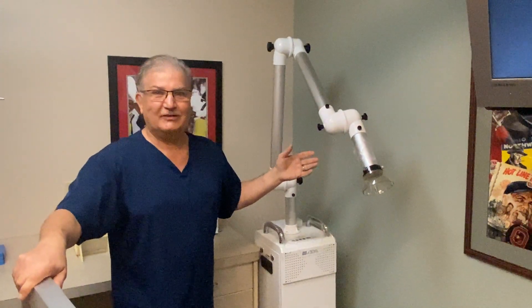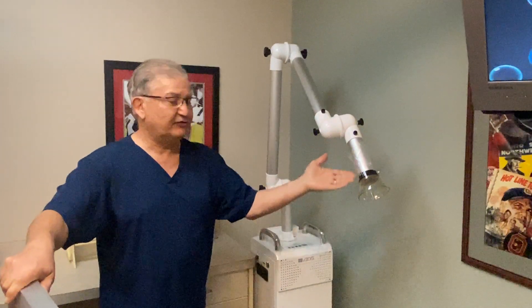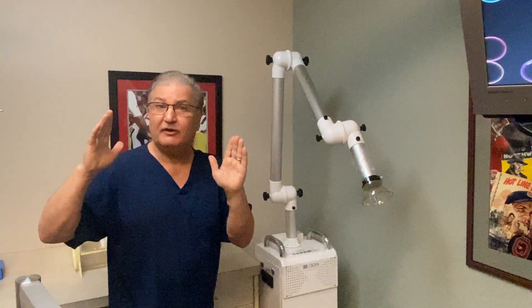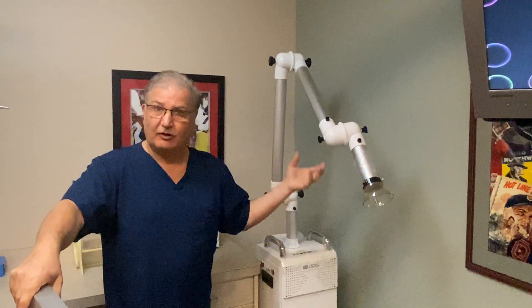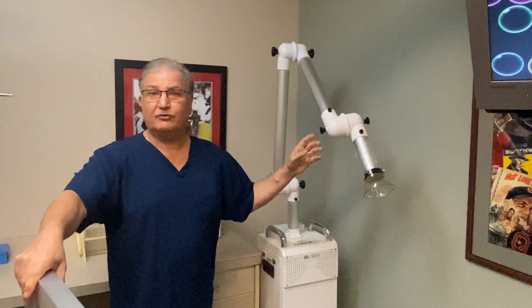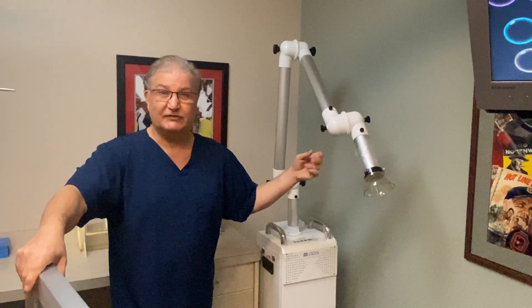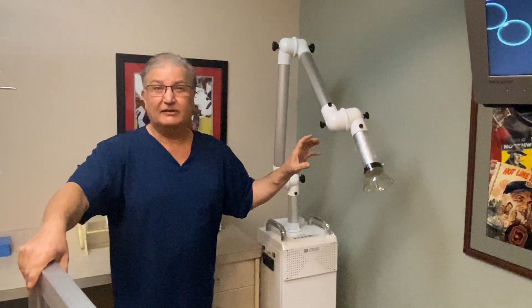This may look like a scary octopus type of piece of equipment, but what it actually does is it allows us to move this arm to put it within a foot of a patient's mouth. It will then draw aerosol — water spray mist — into this unit, where it goes through a HEPA filter and then through an ultraviolet light, so that it kills bacteria, germs, and viruses.